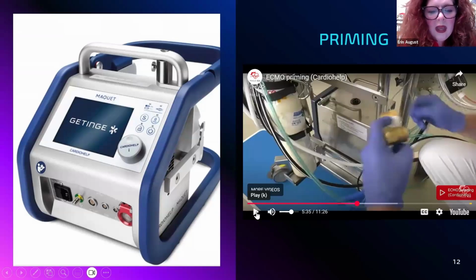But remember, when you add ice, most times it's just coming from filtered water. It is not sterile. So you have to put it into a plastic bag, almost like a goldfish, make a knot, hang it to the side, and just let the ice down in the water in a plastic bag. They have found here in the United States, when tracking back when we had issues with the mycobacterium in the heater coolers, that it was from tap water that was put in. So we make sure we put our ice into a plastic bag before placing it in there if we do need to go that far to bring down core temperature.